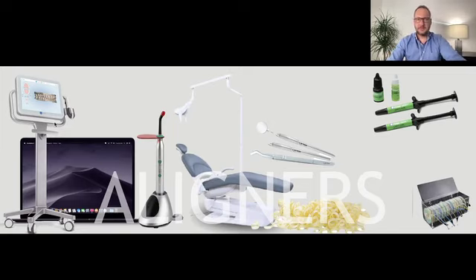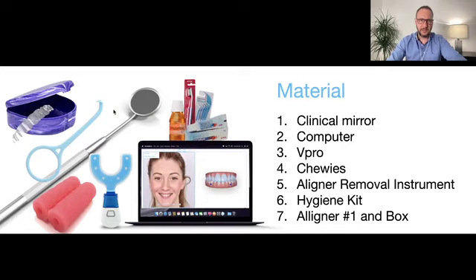For those who have access, the scanner is a very important tool to help us in our daily routine with orthodontics and aligners. I pretty much have these three instruments: a mirror, a probe, and a plier, a simple clinical plier. Elastics, some buttons, some composite, not a big deal. This is how much my clinical routine has been reduced regarding materials. The first appointment is a very educational appointment. Of course, this is the way I do it; depending on each doctor, you can have different routines and you can agree or not.